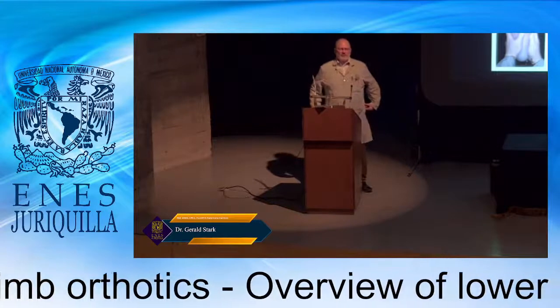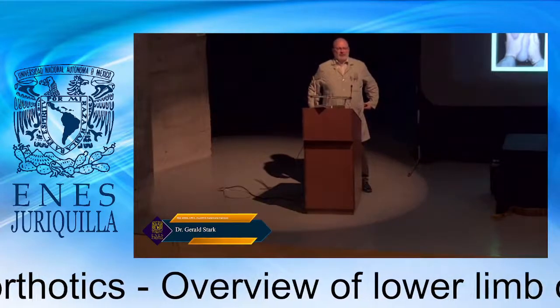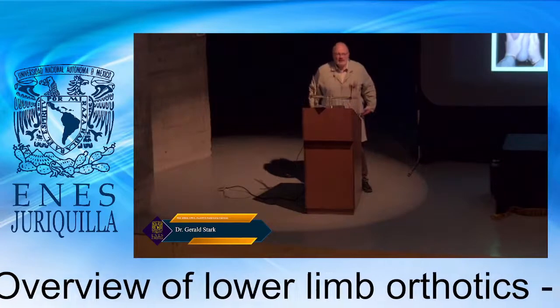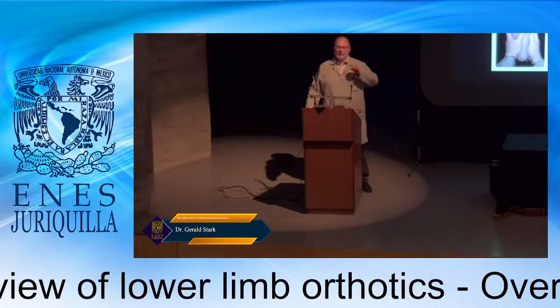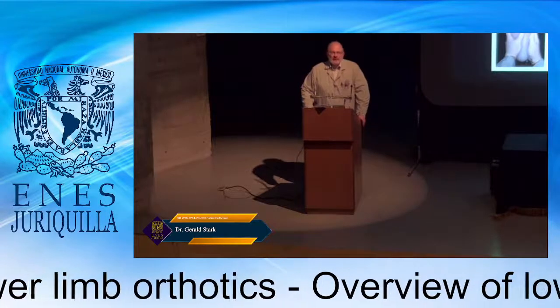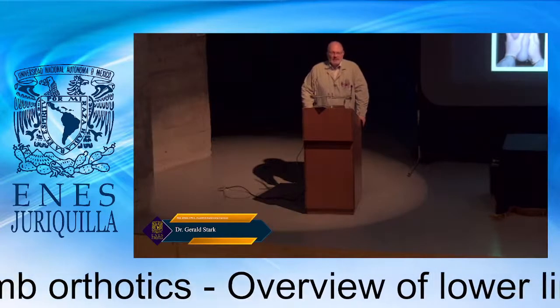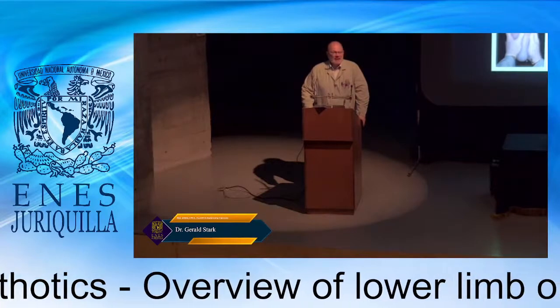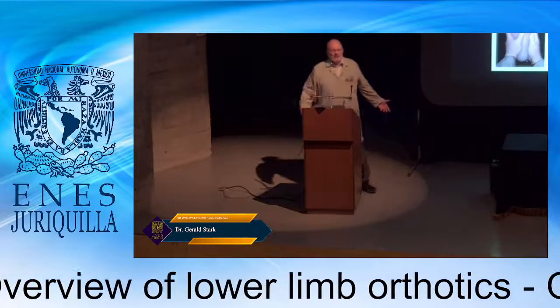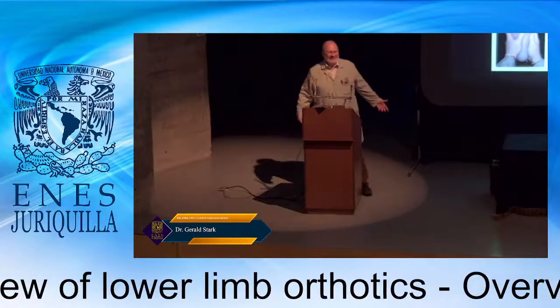They should be fitted with a slight anterior lean on the ligaments of Bigelow, so upright. Unfortunately, sometimes they were fitted poorly. In terms of studies, I think there was one by Jim Campbell, who saw that there was a great energy cost, maybe 4 to 6 times the energy cost of using a wheelchair. The question is, no one asked the patients what they thought.